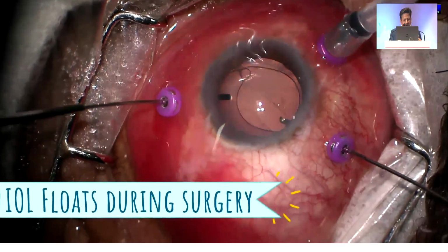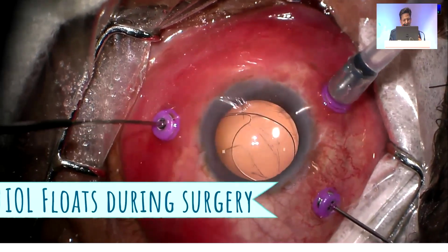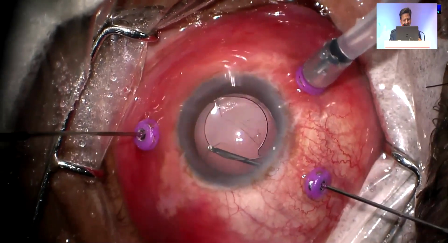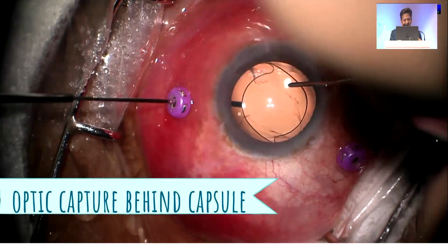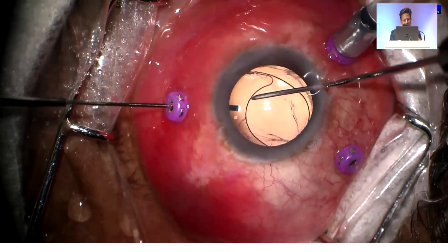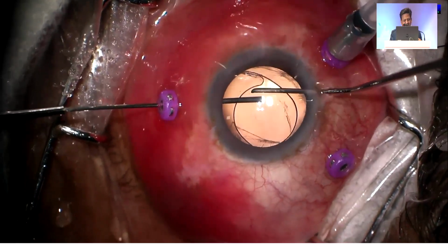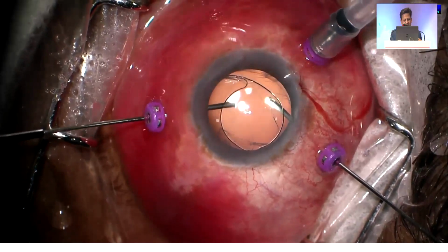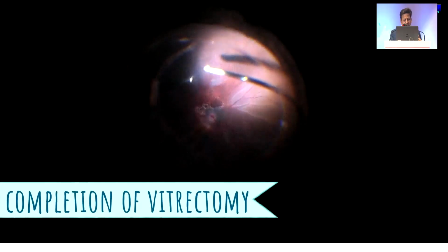In another case, you see the lens that has been used is totally improper, not for the size of the eye that is being used. While we are trying to manage the RD, the lens is moving. And in this case, if we do a fluid-gas exchange, the lens will come into the anterior chamber and cause problems later on. So we had to optimize this lens. We have to bury the optics below the anterior capsule, and then proceed for the vitrectomy.